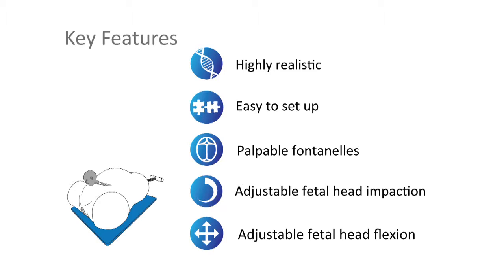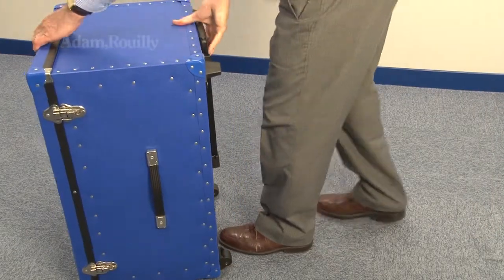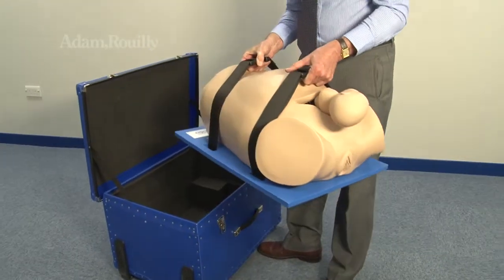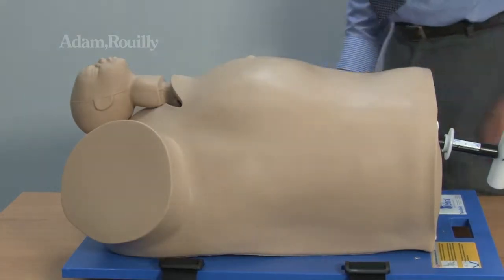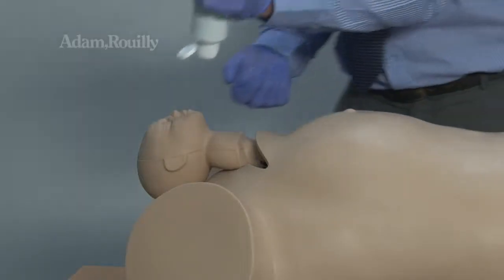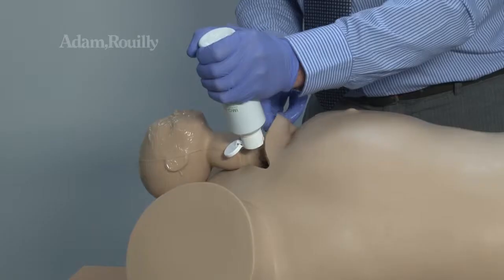The fetal head contains palpable fontanelles, and levels of fetal head impaction and flexion can be adjusted. A carry case is included for easy transportation. Use the straps to transport the model and also for securement to a stable surface. Apply ultrasound gel liberally to the fetal head, abdomen, and birth canal.